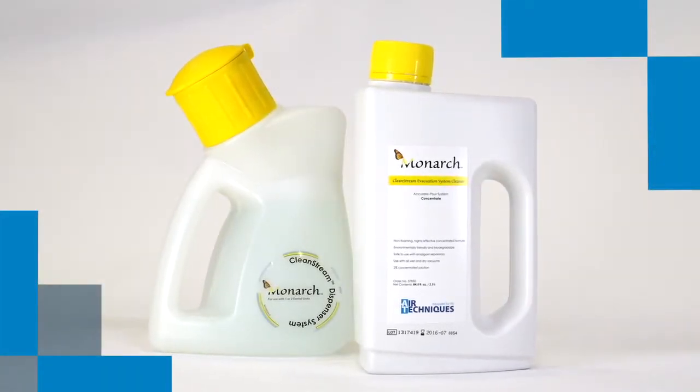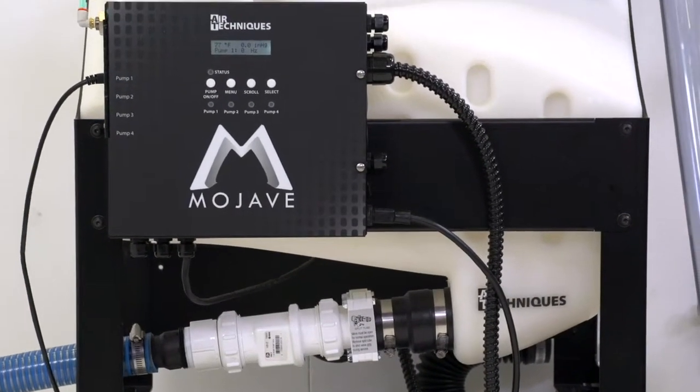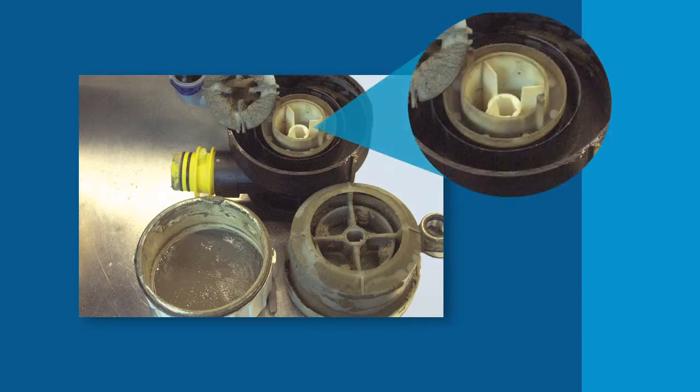Using the correct evacuation cleaning agent is essential to ensure your vacuum system runs at optimal performance. Using the wrong type of cleaner can be detrimental to your system.